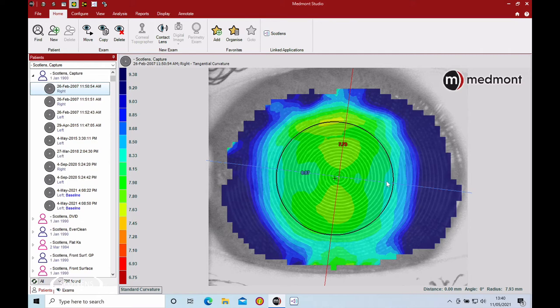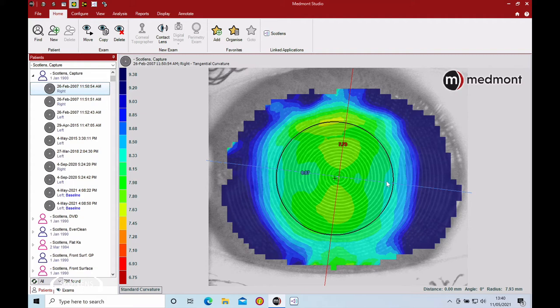Patients will stare in between blinks, so you want to make sure they're blinking regularly in between and just before you do a capture so you're not capturing a lot of dryness. It's good to do multiple captures, especially for a baseline topography. Do right, left, right, left with blinking in between.